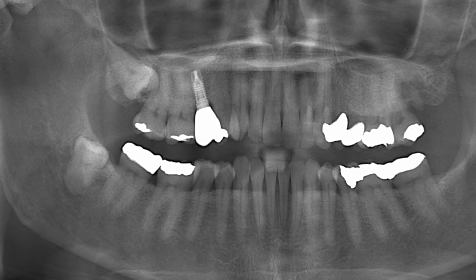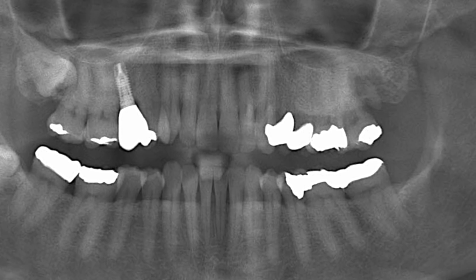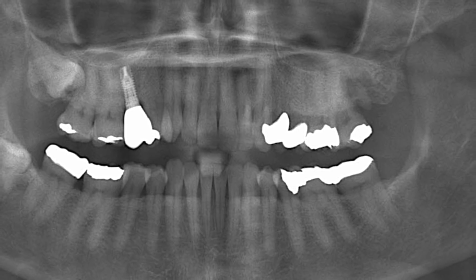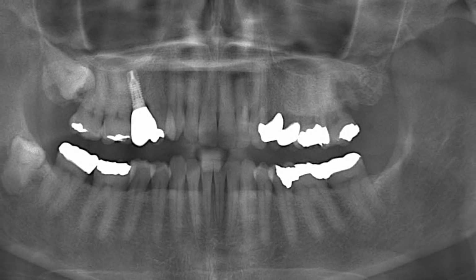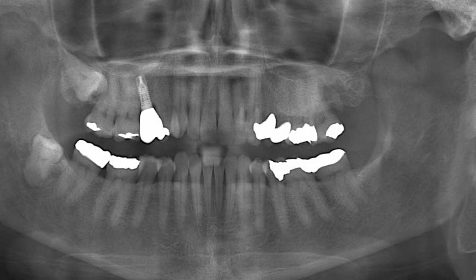Now, my personal theory about the cause of this fracture is, if you look on the right side of the patient, she has a wisdom tooth that is impacted. She told me that the wisdom tooth on the left side had been removed a few years ago. My theory is that during the removal, some type of cryer or elevator instrument was used to remove the tooth following its exposure, and they may have put undue pressure on the distal buccal root of the second molar. The distal buccal root fractured during the extraction of the wisdom tooth several years ago. That could be one possible explanation.